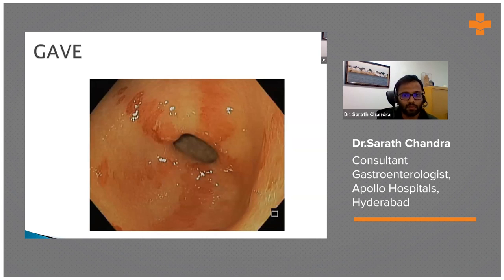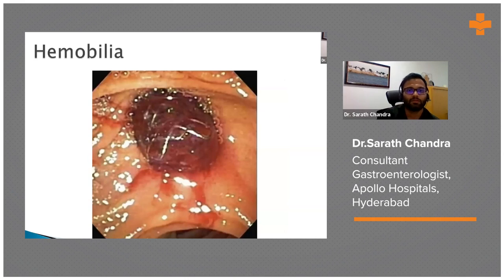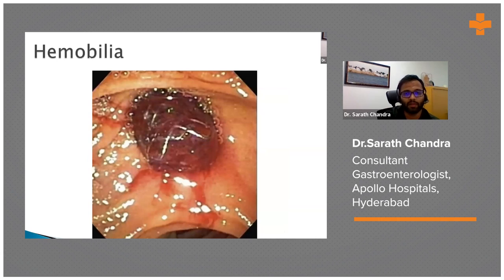For GAVE patients, APC gives excellent results, and banding can also be done. This last picture shows hemobilia — blood coming from the duodenal orifice.